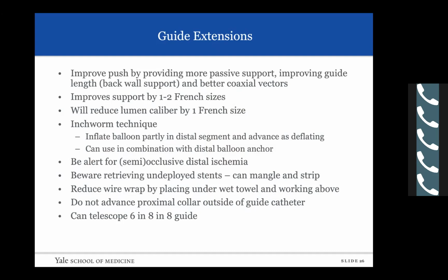Inchworm technique, I think most of you are familiar with, is just inflating a balloon partly in the distal segment. And then as that balloon is deflated, tracking the guide extension down. And then you can use that also in combination with a distal balloon anchor, and you can frequently get a guide extension very far down the coronary artery. As before, only inject when you see a clear pressure waveform, and also be alert for occlusive or semi-occlusive distal ischemia, because remember the guide extension is taking up a large portion of that coronary lumen.